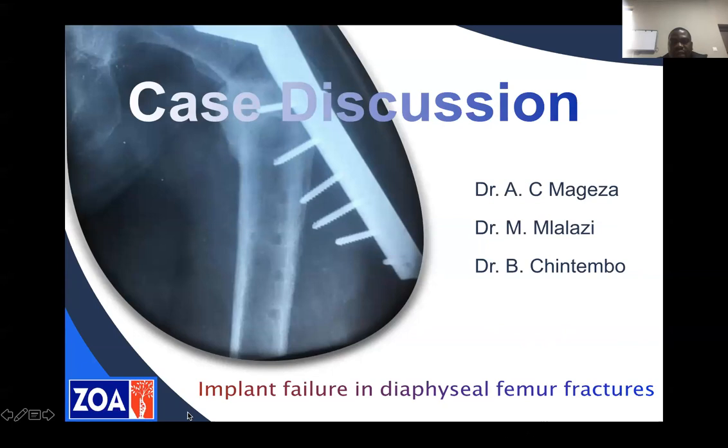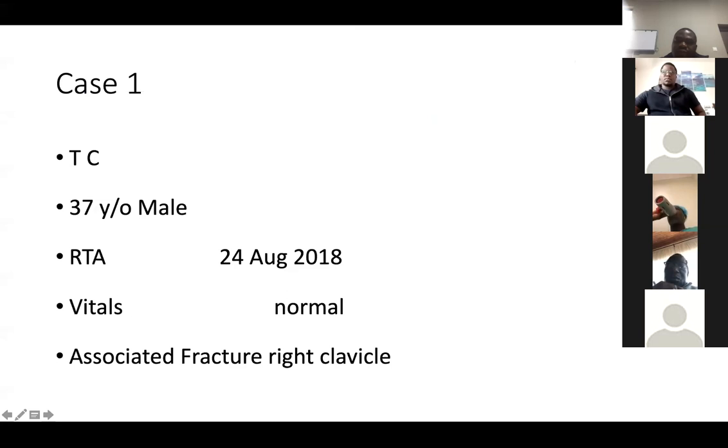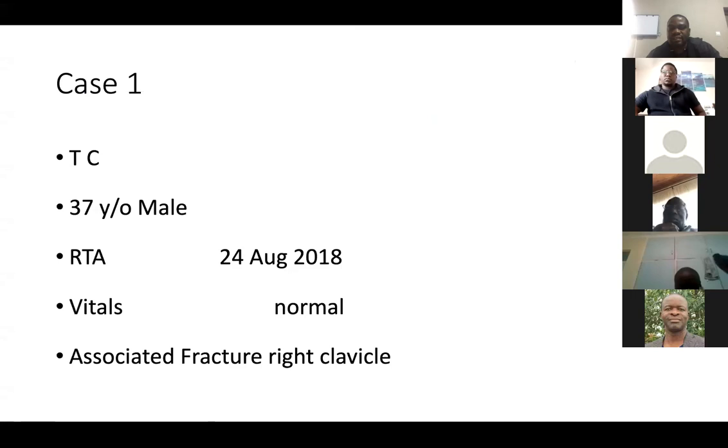I'm going to present on two cases, and there is no guru on these cases. It's a learning opportunity for all of us, and everybody is free to stop me and contribute wherever you deem necessary. So case one is a 37-year-old gentleman who was involved in a road traffic accident sometime in 2018, about 3.5 months before he presented to me.